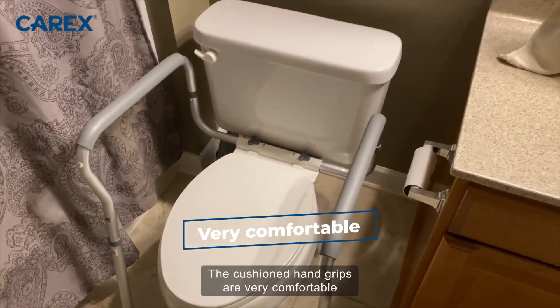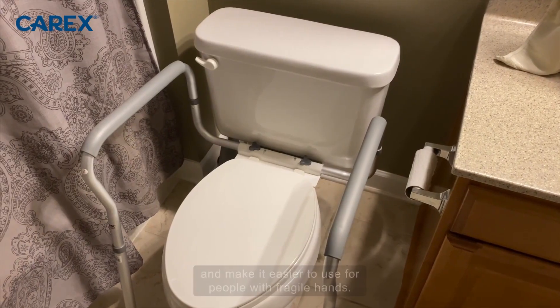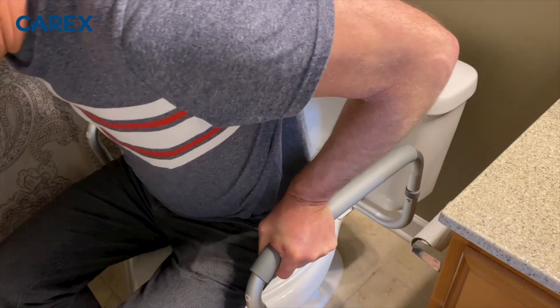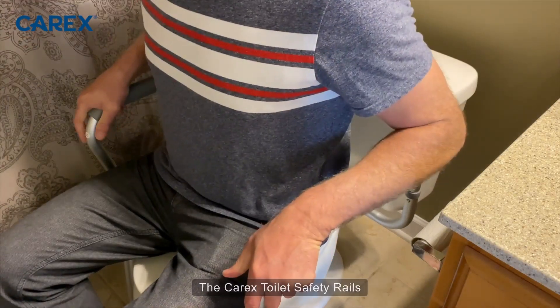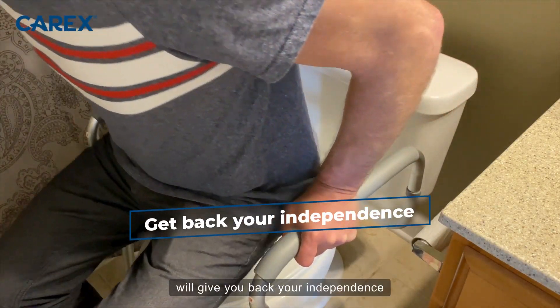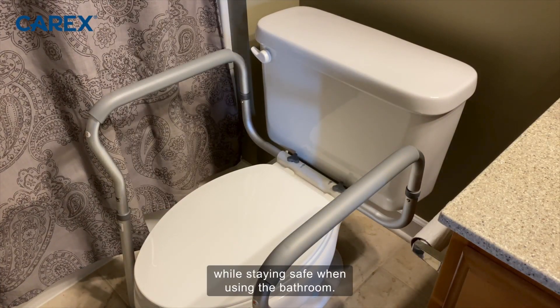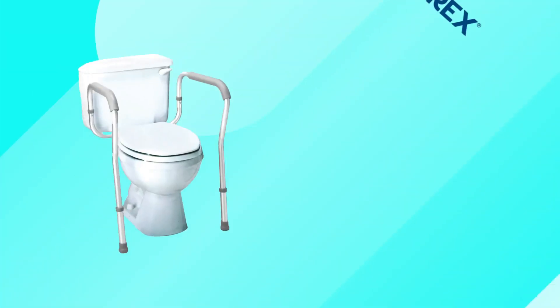The cushion hand grips are very comfortable and make it easier to use for people with fragile hands. The Carex Toilet Safety Rails will give you back your independence and quality of life while staying safe when using the bathroom. Get yours today!